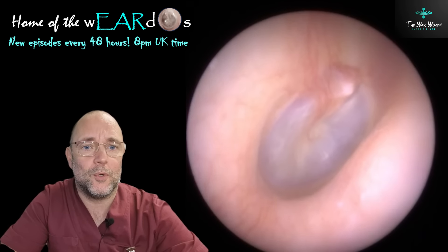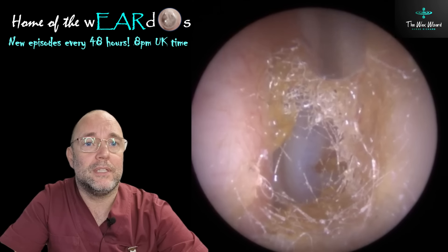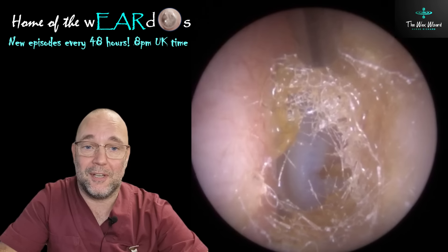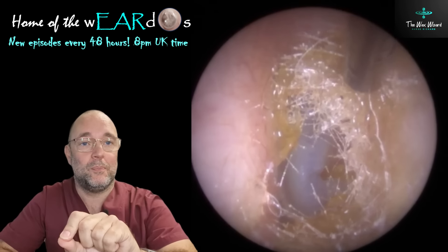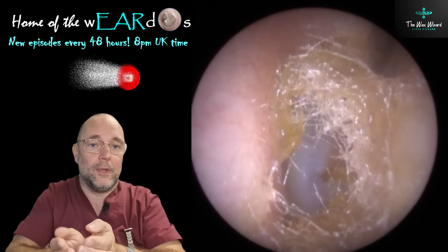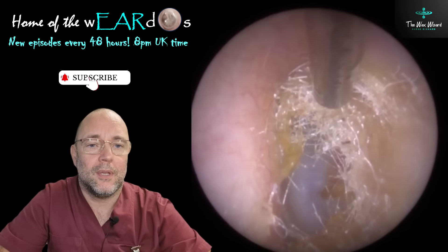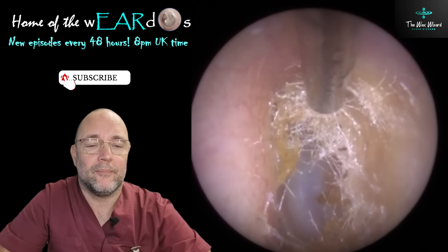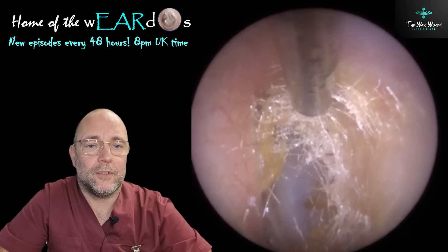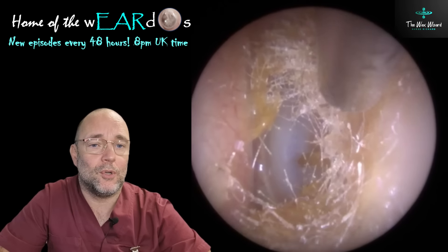It's not affecting the hearing too much, but it was incredibly itchy. And I'm not surprised when you look at all these cotton wool fibres in there — it's definitely cotton wool fibres, not fungus — because she's pushed it in like that. The wax that she had, she's mushed it all the way around the canal wall. This one was a bit awkward, a bit tricky, because she's pushed it right deep down in there as well. So it's a bit too deep, in my opinion, to start getting some tools in down there with forceps and whatever.